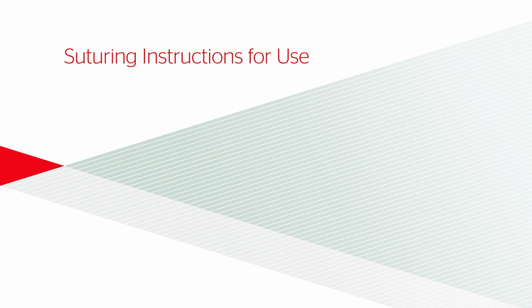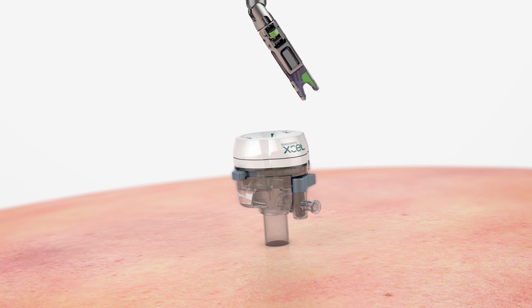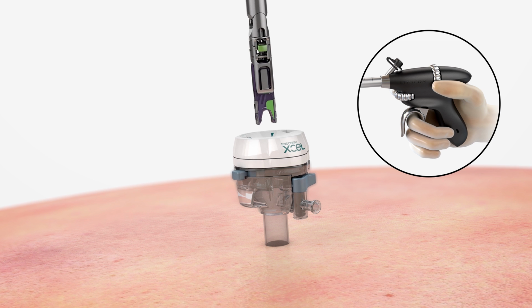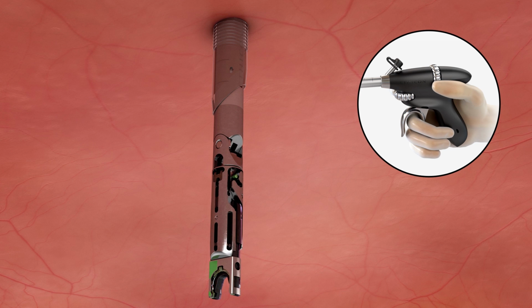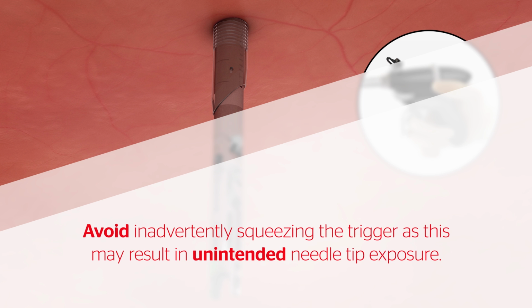Suturing instructions for use. When inserting the instrument into the trocar, ensure the instrument is straight and not articulated. Insert through a 12mm trocar until the articulation joint on the instrument is visible past the tip of the trocar cannula. Avoid inadvertently squeezing the trigger, as this may result in unintended needle tip exposure.